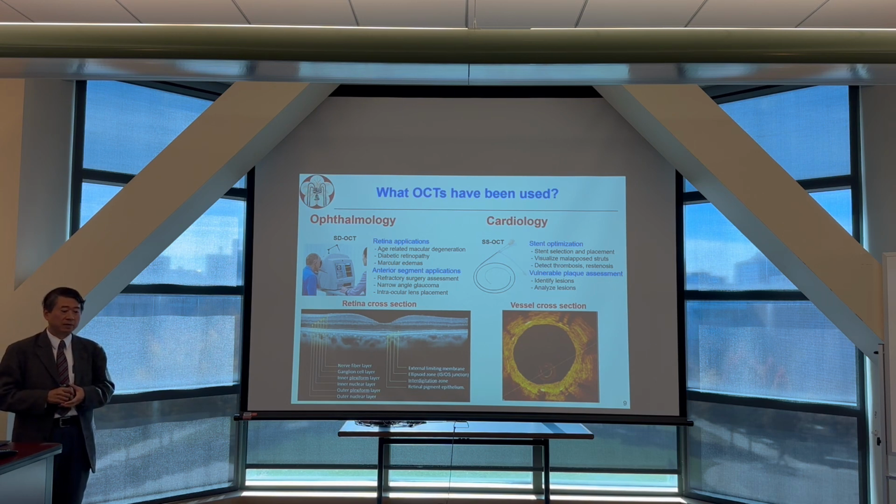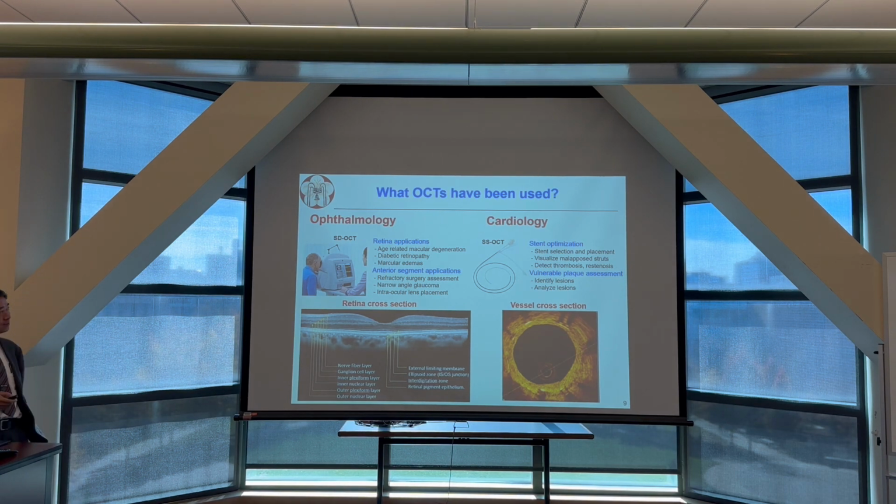I believe worldwide, 1 year ago I heard there were about 100 OCT companies. But I believe right now it should be much more, because I just visited India 2 months ago. People told me in India there are about 25 OCT companies just in India. Roughly 80% of the OCT companies right now are working on ophthalmology.